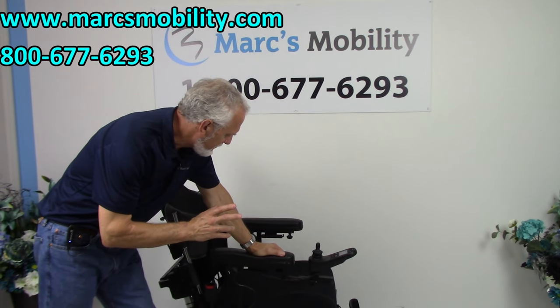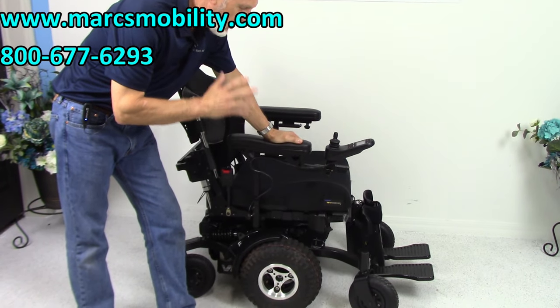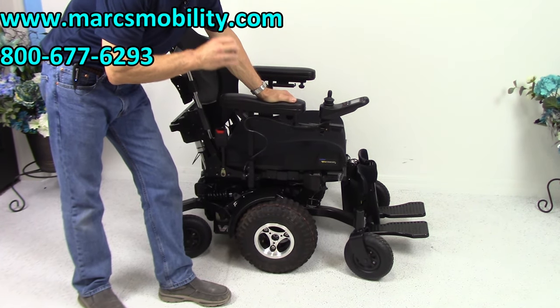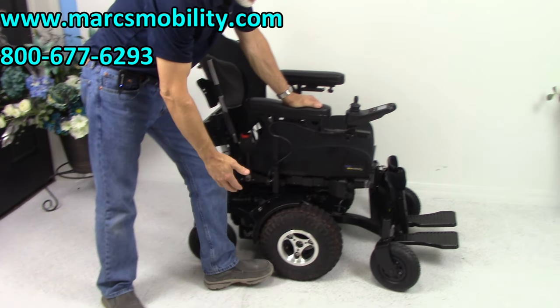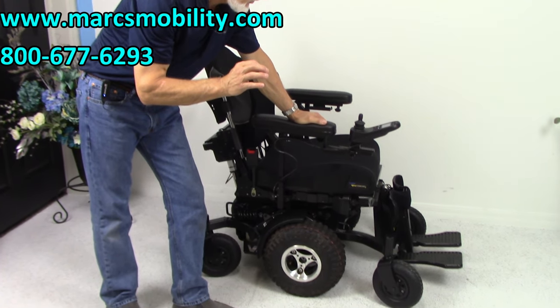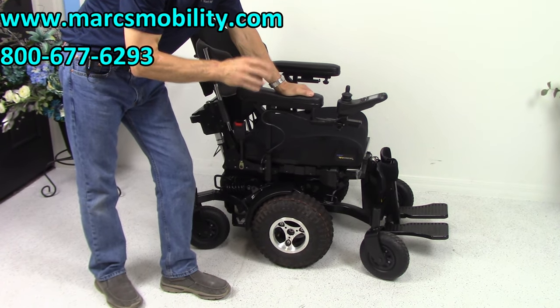This is a Magic Mobility Frontier V6 power chair. This is a one-of-a-kind power chair — a six-wheel chair considered an extreme power chair because of the frame, the power, and the size of the low-pressure tires. This power chair has 17 miles on it, so it's practically brand new. This is the first one I've ever got in here that's fully loaded.